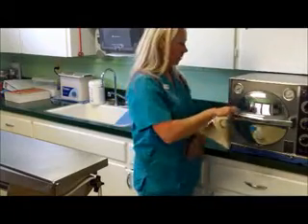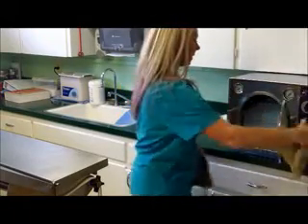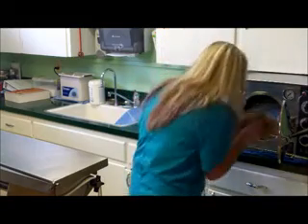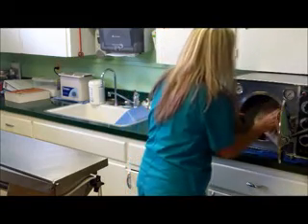We can now take the pack out of the autoclave, and we are going to sit it over here on the table to dry.